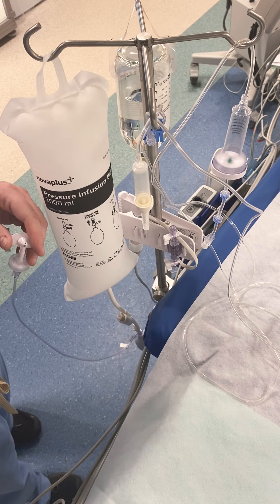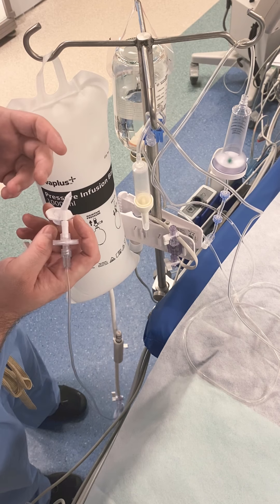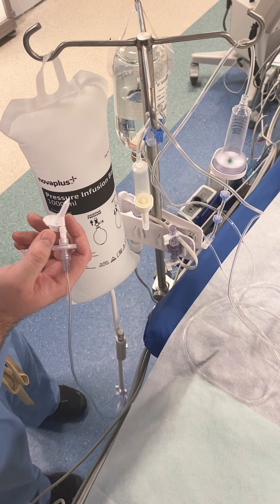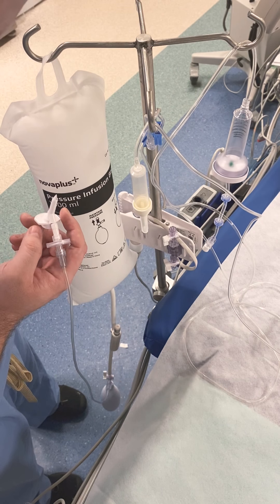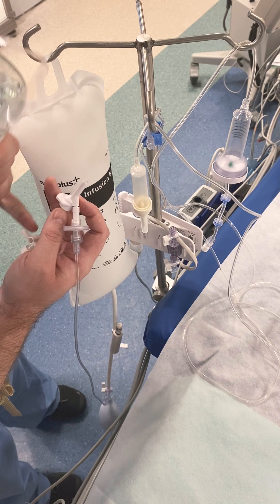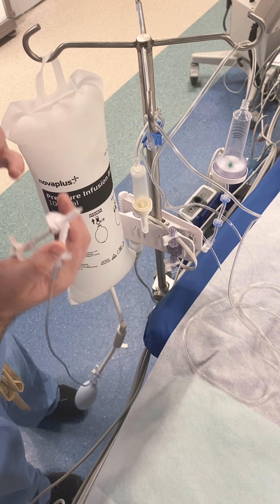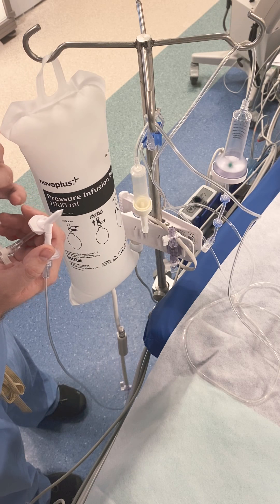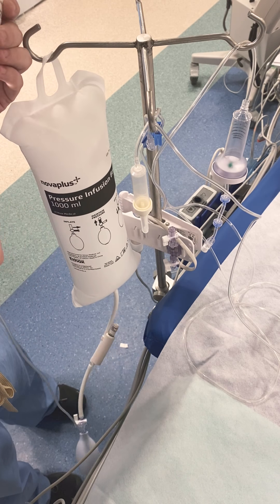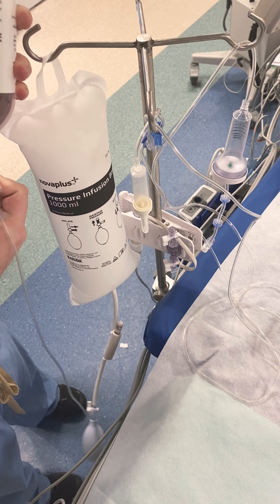Think about it — if you had a two-liter bottle, took the cap off, and turned it upside down, it would go 'bloop bloop bloop' because air has to go up and the liquid comes out. With this setup, air goes in through a separate hole and contrast comes straight out the other side, so we don't introduce a lot of air into your manifold. We'll spike the contrast with this.